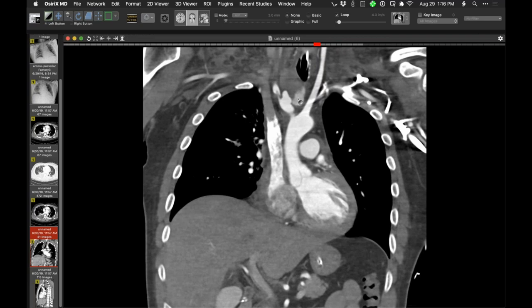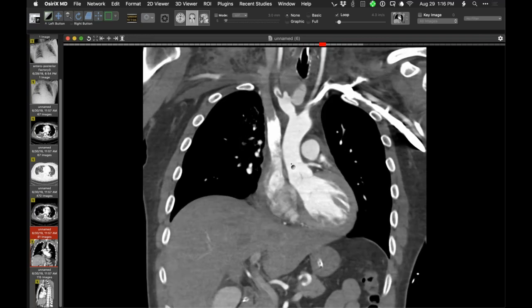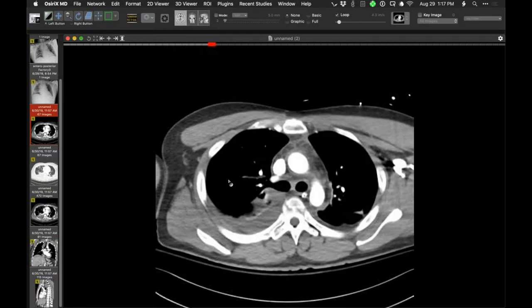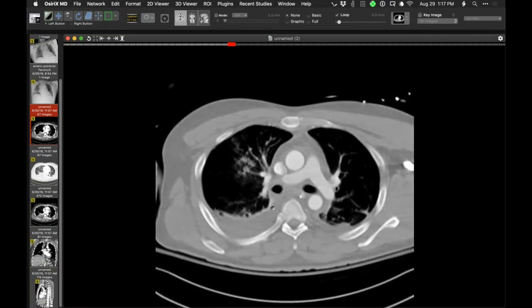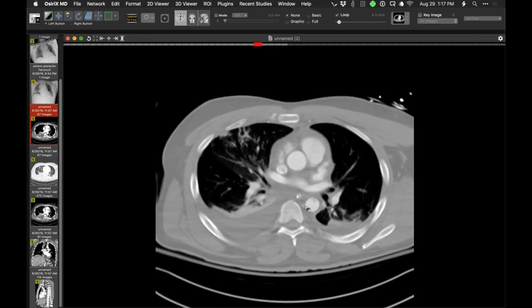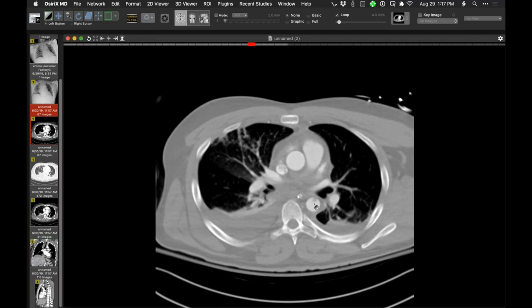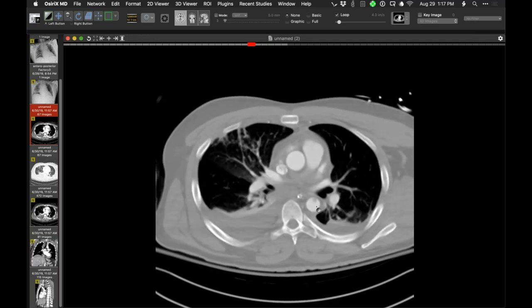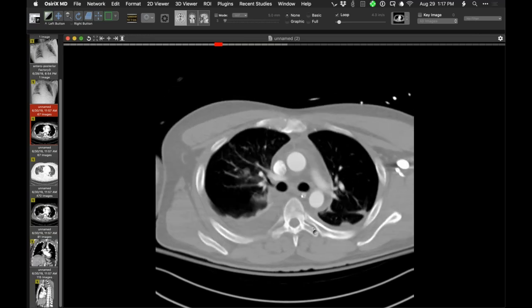They operated on this patient to fix that. Regarding the descending aorta, that was just observed. We have minimal aortic injury — kind of a type one injury, maybe two of them. Perhaps what we have here is mostly a little thrombus adhering to the intimal injury. That was not managed by any kind of intervention.